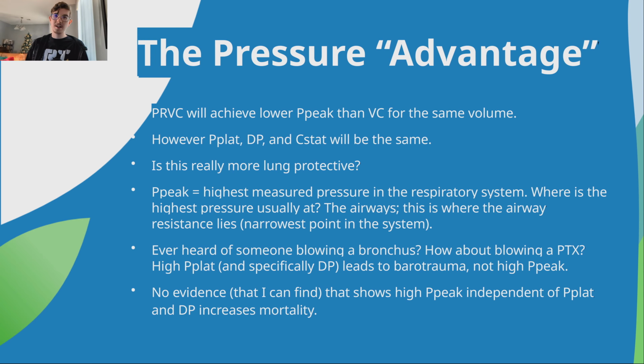Now, I'm not saying high peak pressures are good, okay? I'm not trying to sit here and tell you not to care about peak pressures. Obviously, peak pressures are still important to monitor, but if we're talking about being lung protective, if we're talking about mortality, if we're talking about ARDS, whatever, we are talking about driving pressure. We are talking about plateau pressure. We are not talking about peak pressure, okay?